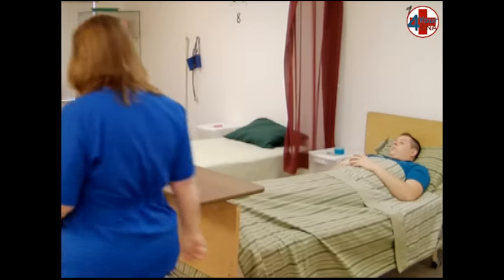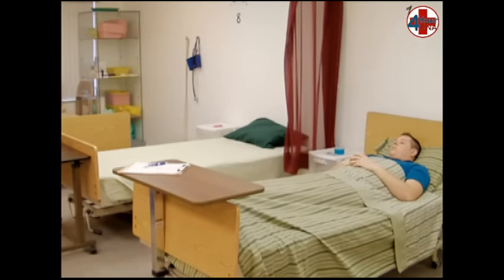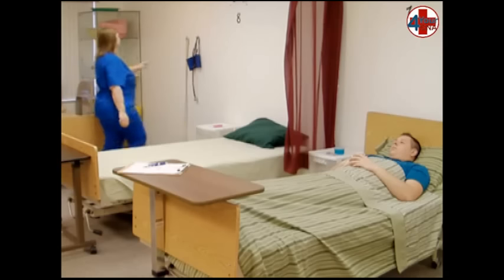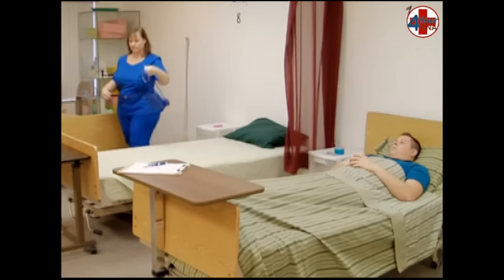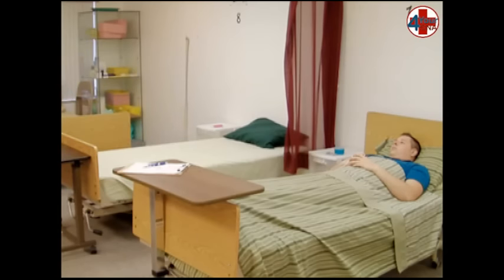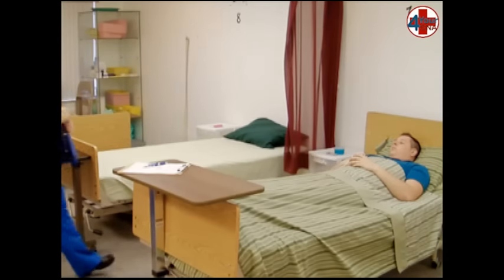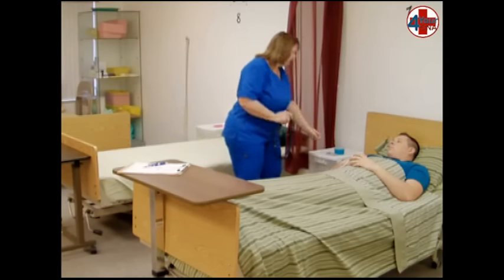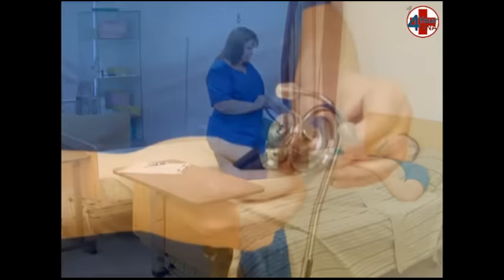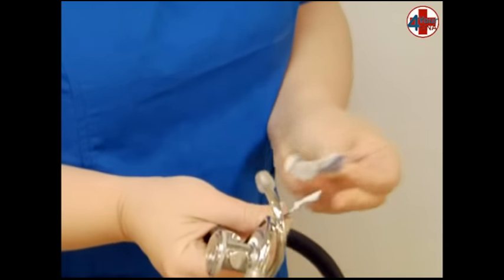When you return, gather your stethoscope and blood pressure cuff from its storage area. Ensure that the blood pressure cuff has been completely deflated. You will be using the testing center's equipment, which includes a double-sided stethoscope so the evaluator can listen as you perform blood pressure. Pick up an alcohol pad and explain to the patient what you will be doing.